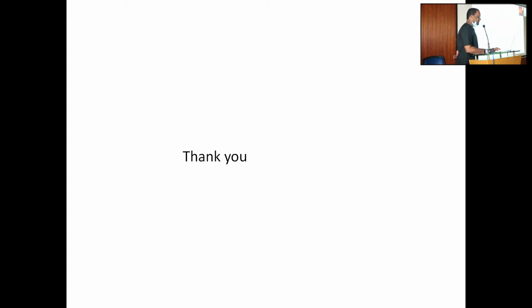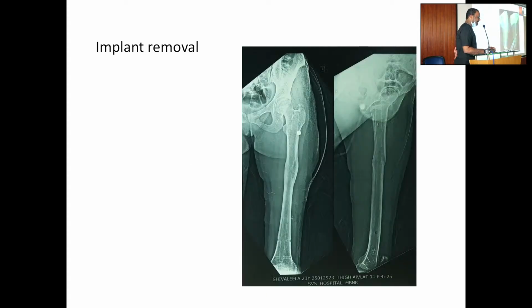What is that circular? Is it related to the implant? No, sir. Is it in the pocket? Here in the lateral view. And it's away from that. Okay.